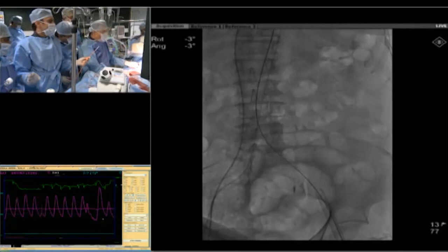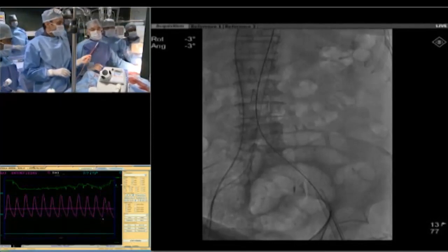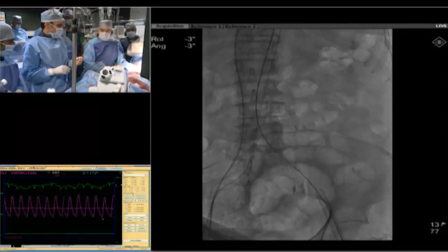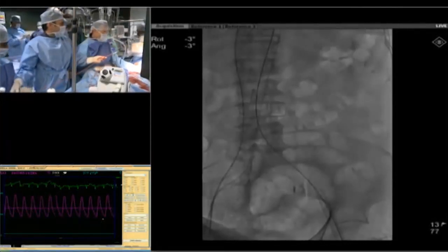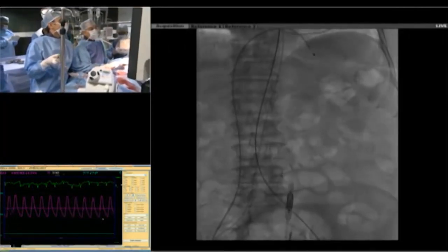Patel, Vijay, you have to make sure that the wire goes in. What happens sometimes is that when the patient drops the pressure, there is a movement of the patient. So you need to make sure the legs don't move, otherwise things get pulled out, right? So we're ready. All right, so we'll do a fluoro check of the valve. Let us see how it is loaded. It's loaded. Okay, mag up, please.